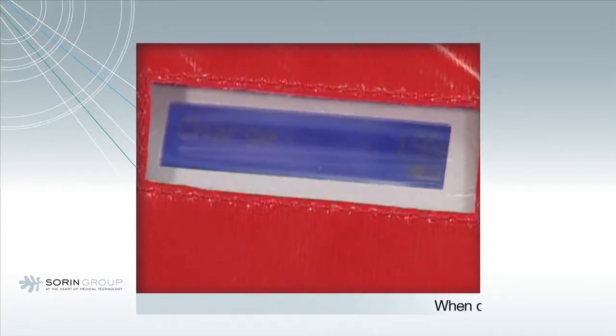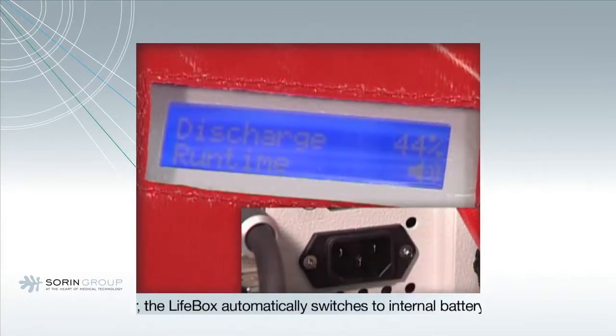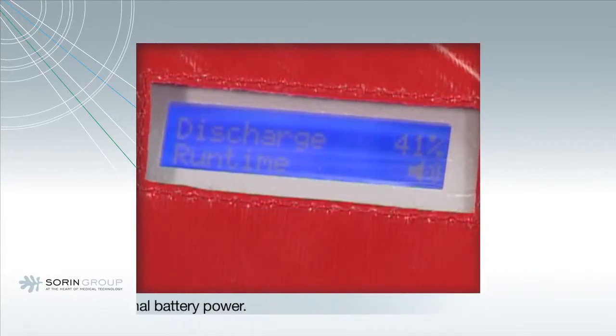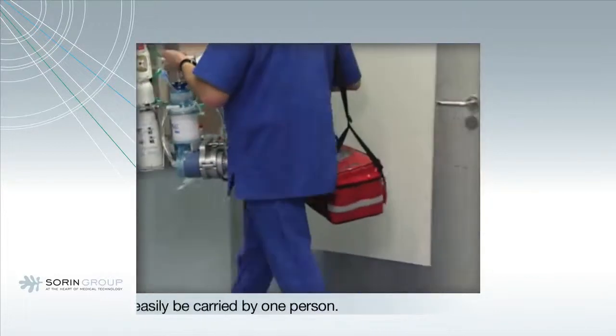the display shows the charge and the actual capacity of the battery. If the mains power connector is removed, the LifeBox automatically switches to internal battery power. The LifeBox can easily be carried by one person.